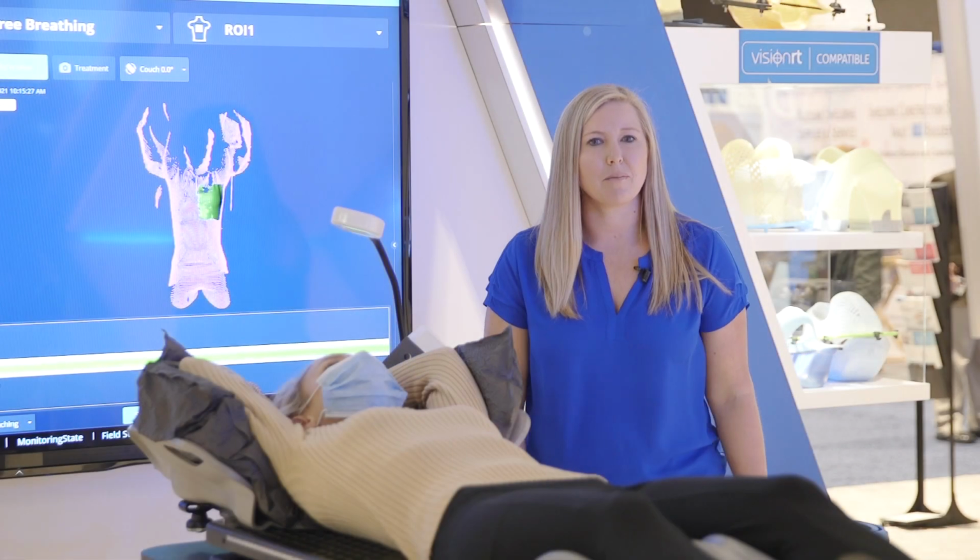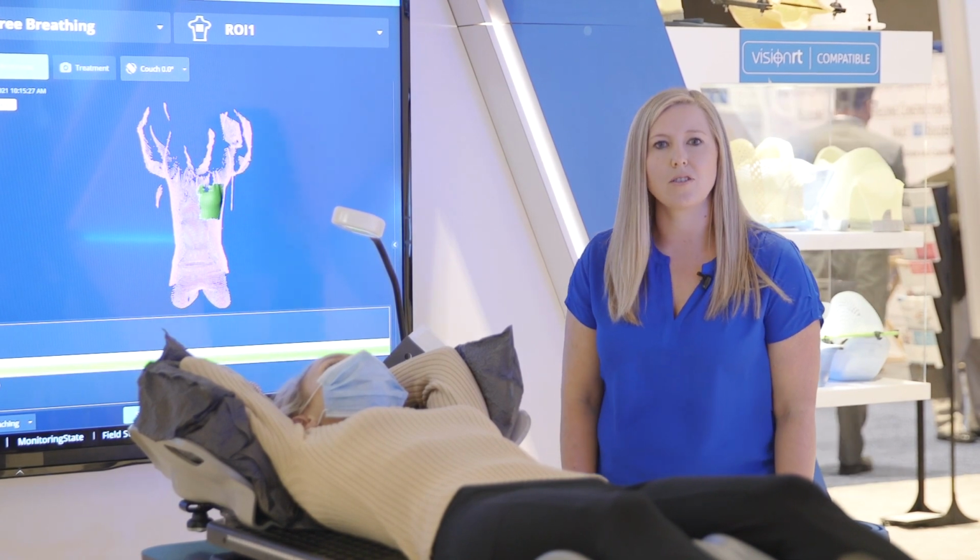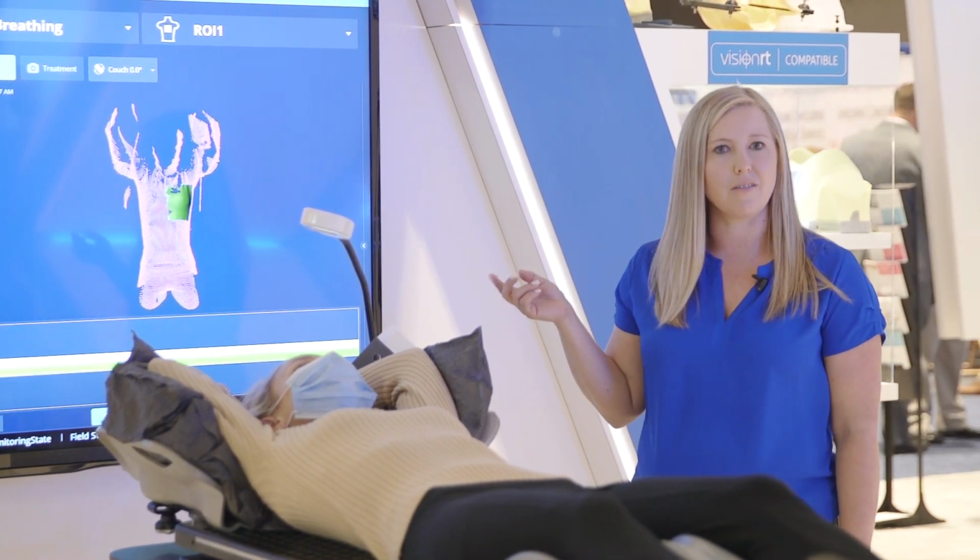Thanks, Maddie. My name is Meredith Smith. I'm one of the clinical application specialists with Vision RT, and we're going to show you how to do the DIBH workflow here at our Align-RT Advanced booth.